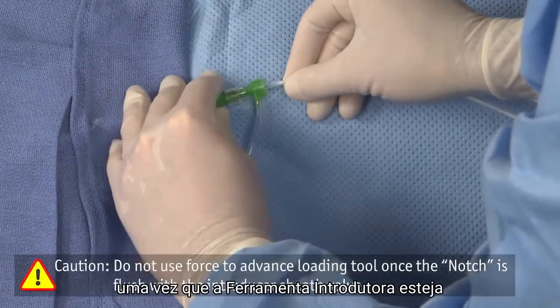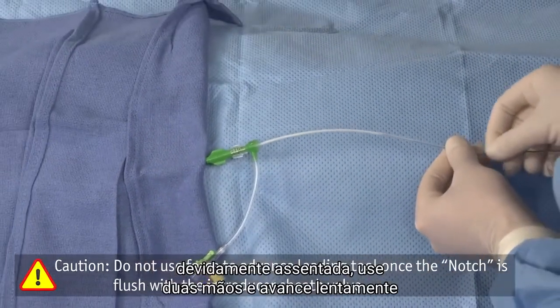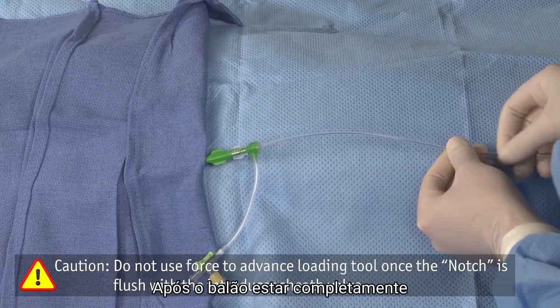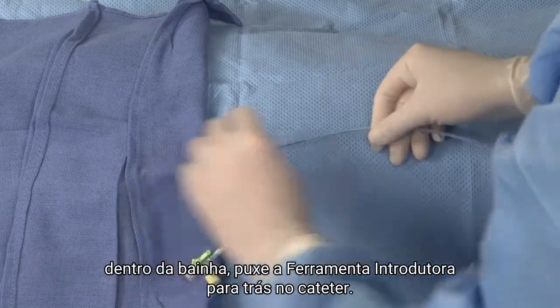Once the loading tool is properly seated, use two hands and slowly advance the Ranger DCB into the sheath in short increments. After the balloon is completely in the sheath, pull the loading tool back onto the catheter shaft.